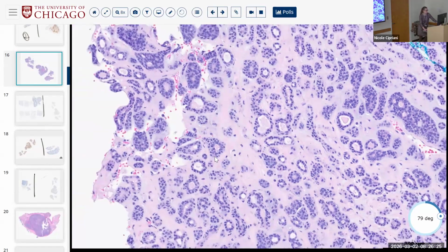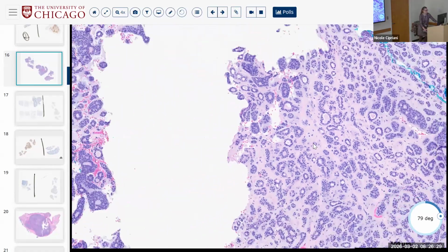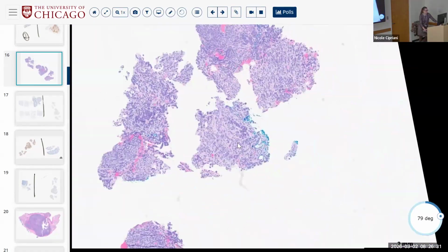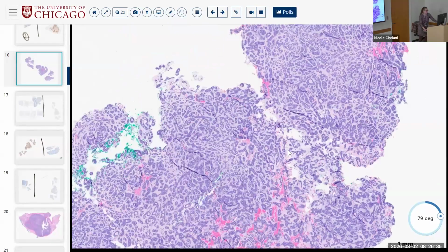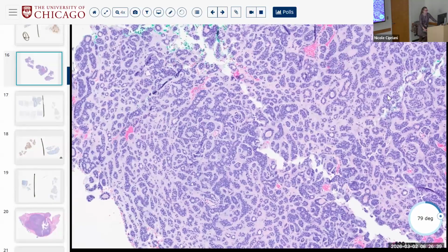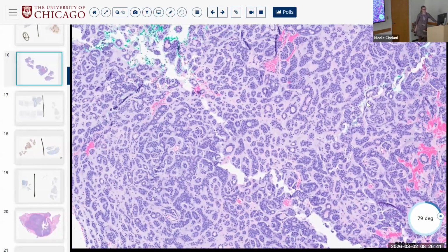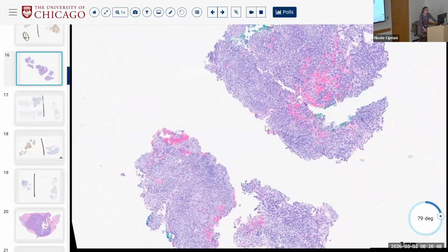But I'm still like, what looks like this? Even though I know salivary can look like a lot of different things. So I was thinking of things that look sort of basaloid, this is very purple. So I was thinking about adenoid cystic. But I know pleomorphic can look like this, so I think the differential could be relatively broad.